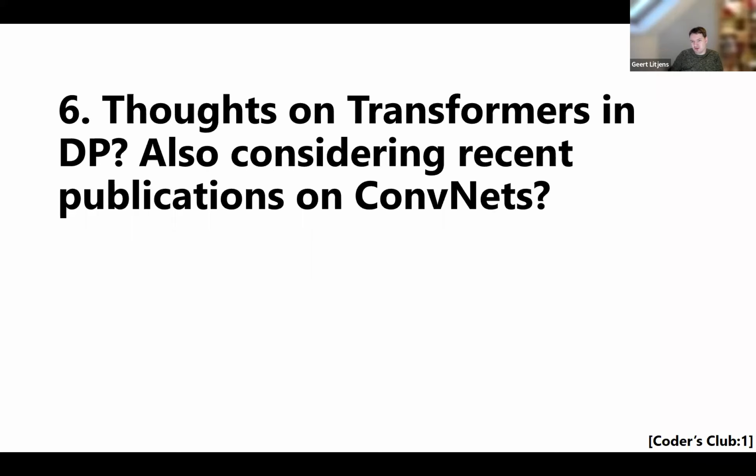So I wouldn't just replace your ConvNet with a transformer. I'm not super confident that would be very sensible to work on, but I think there might be use cases in weakly supervised learning where you have some use of attention mechanisms. I think you need a good rationale to do it, and preserving the spatial relationships is a very good rationale.